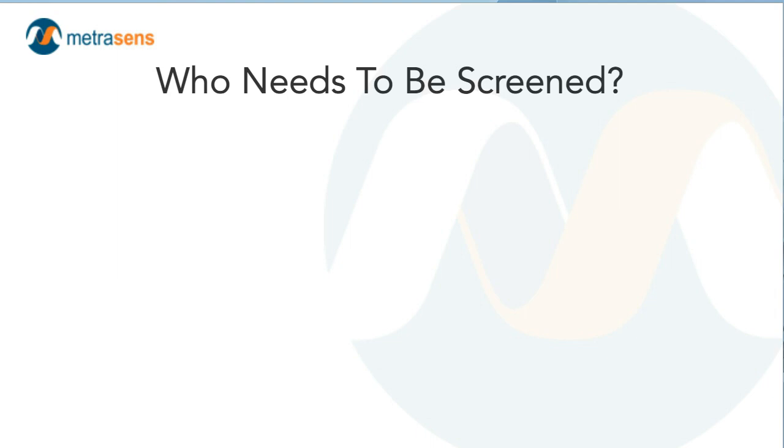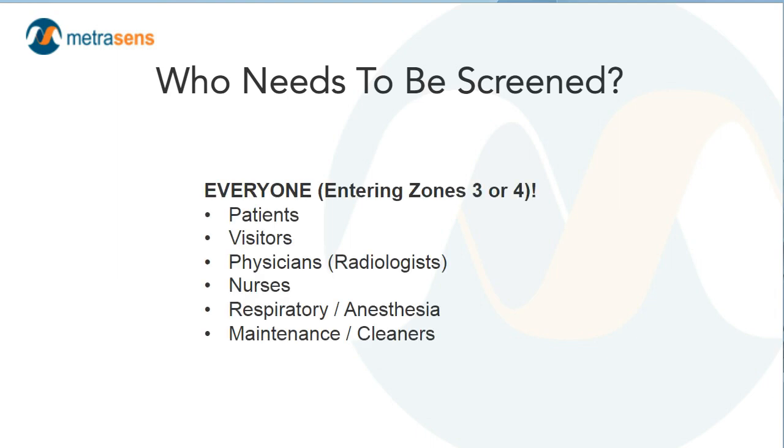So this means, obviously, patients, but any visitors, anybody who might be accompanying a patient, the physicians, including the radiologists, nurses, respiratory, anesthesia, engineering, maintenance, cleaning staff, anybody who comes into the controlled access part of the MR suite, we want to make sure that we're not jeopardizing their health and safety or the health and safety of anybody else in the suite.